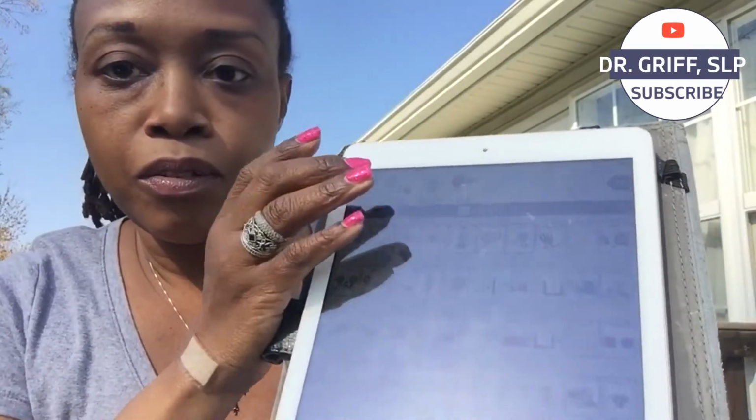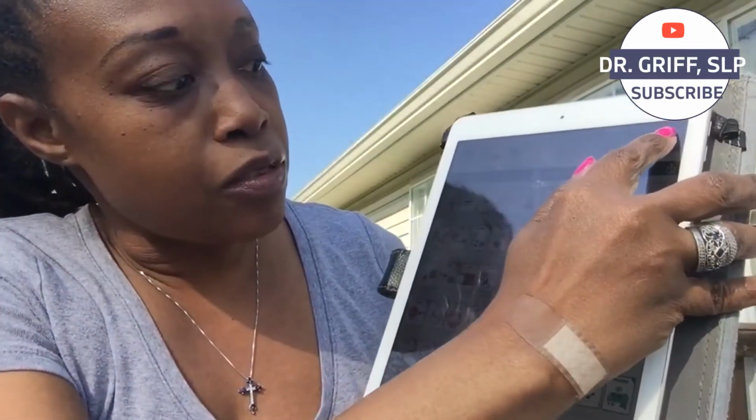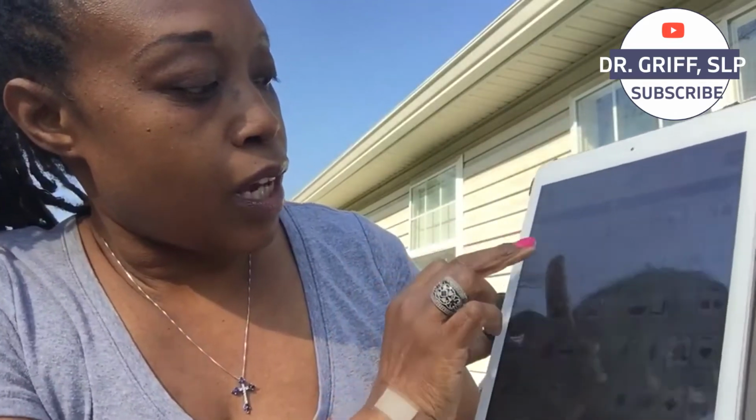I want bubble pop. I want to read the book. Or I want to pop the bubbles so we can clear our message. Say I want bubbles. I want the bubbles. And we can take them outside.